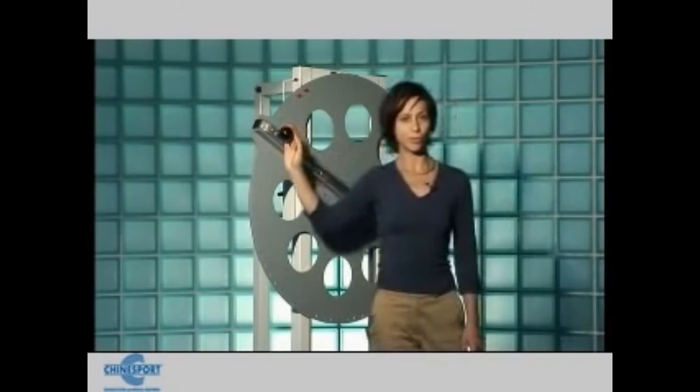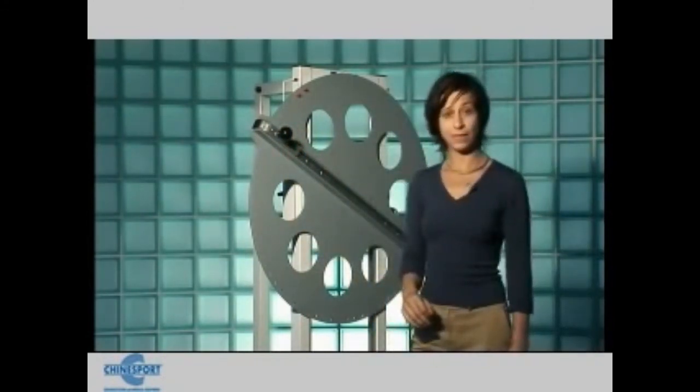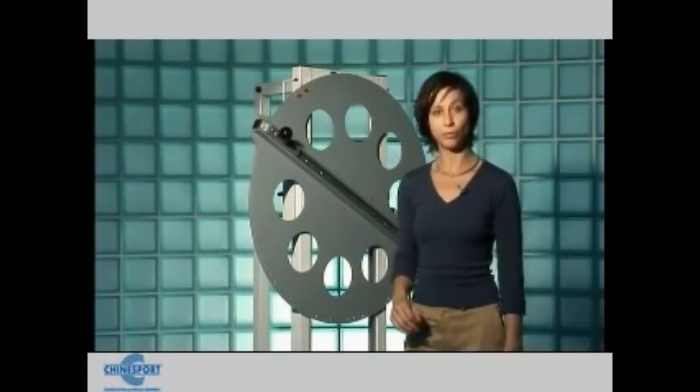This proprioceptive exercise improves the sense of position. Changing the patient's position obviously also changes the direction of movement.